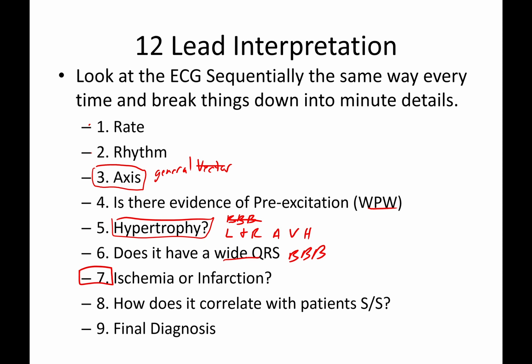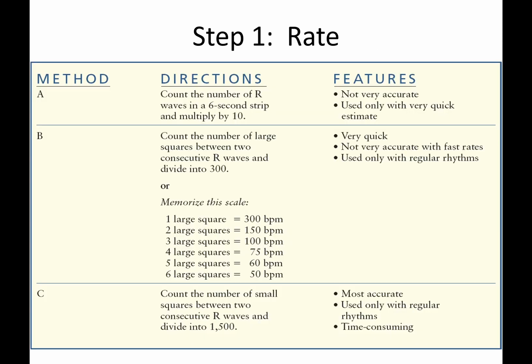I realize MIs are super exciting, but we're going to try and keep that to the latter half because everything that comes before it does have great value. And then last but not least, we always need to correlate symptoms with what our tests are showing and then putting together a final diagnosis. So without further ado, rate.